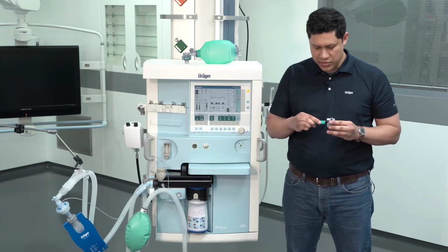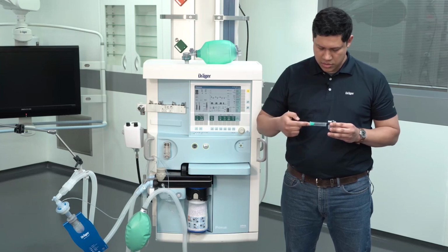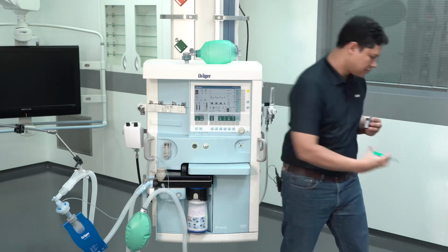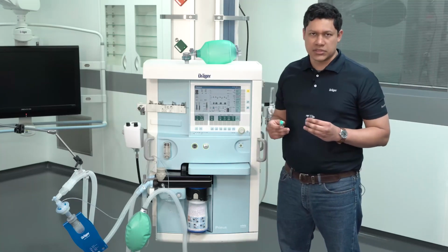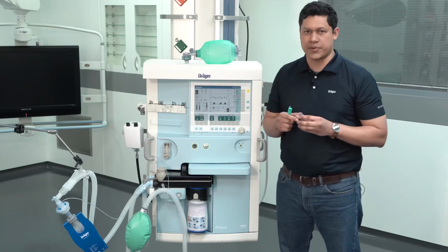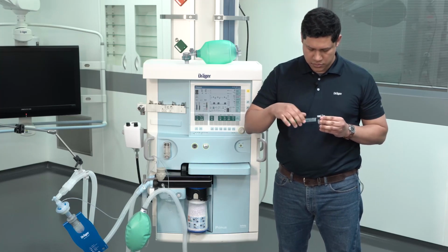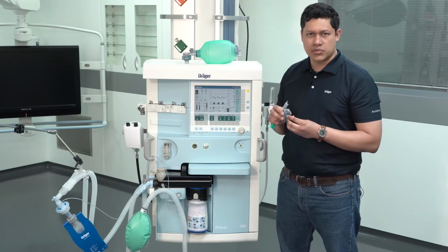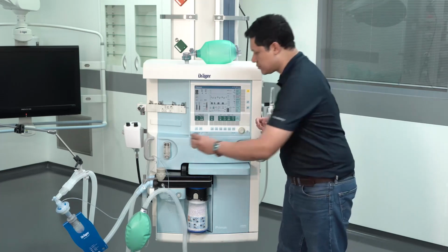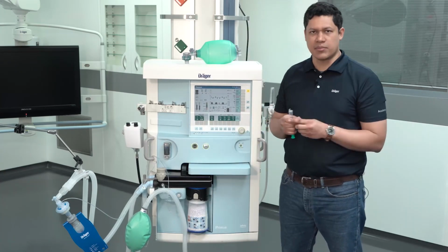You place it on the lower color port, and you drain its content. You might repeat the process if you still have some water in the trap. After that, place the empty water trap back on the port and tightly reconnect the sample line.